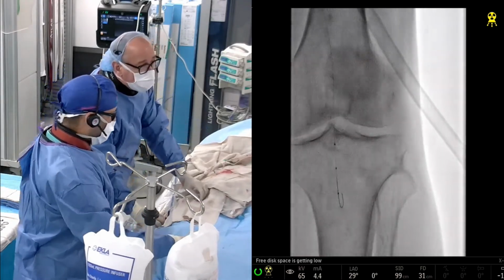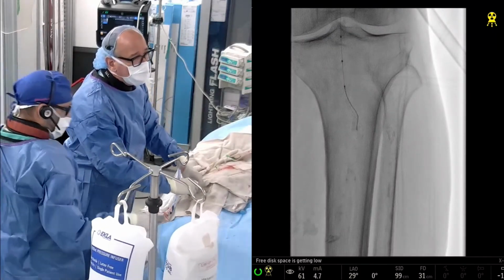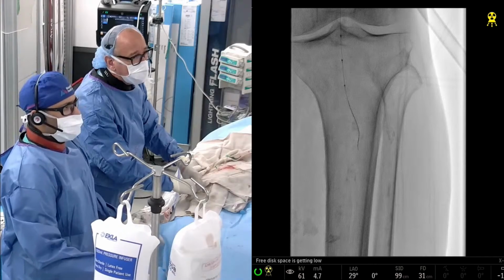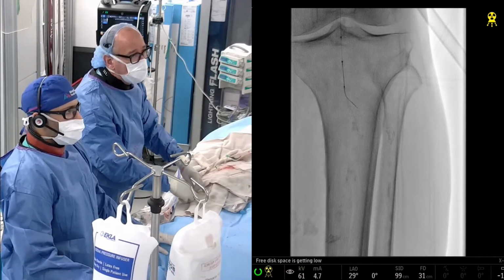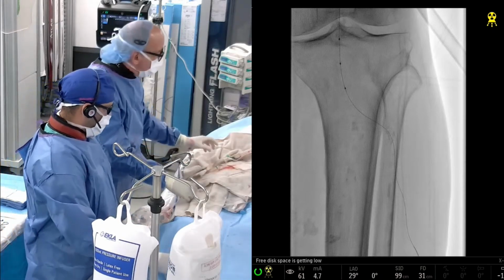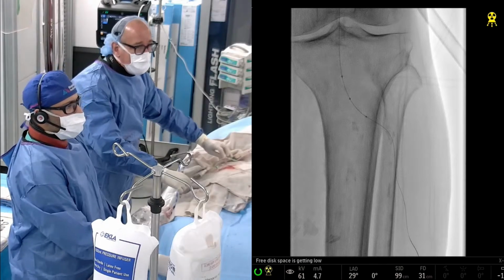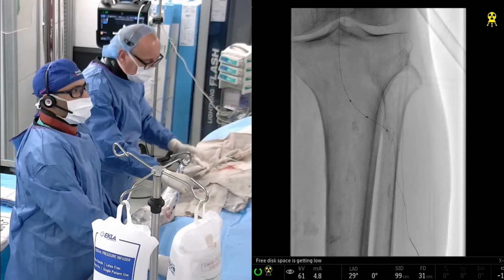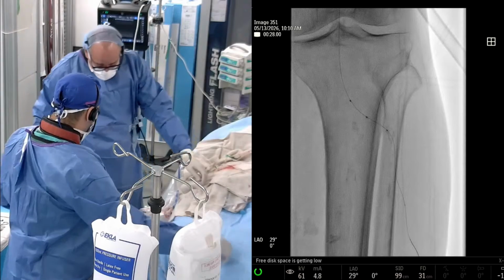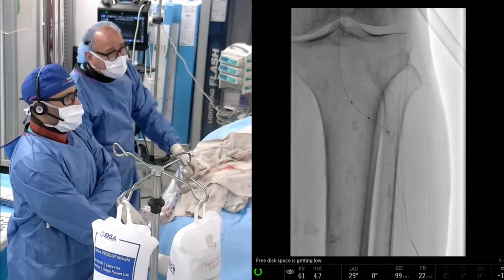So I'm going to see now if this loop will allow me to catheterize the AT. And more often than not, I find this is a little bit of luck. But we'll see. There you go. There you go. All right. Nice, very nice. All right. And clearly I'm off the path, right? So that is not the true lumen of the AT, but it allows me now to focus myself and get myself reoriented so I can wire it.